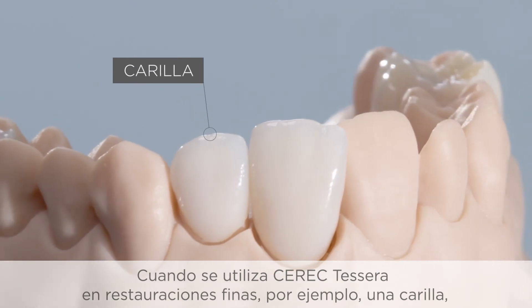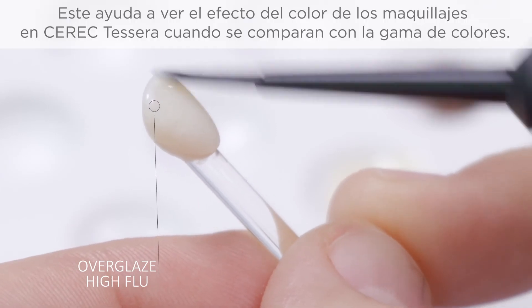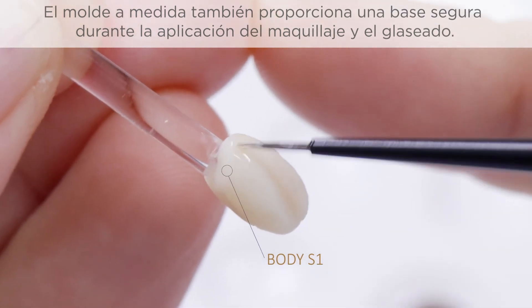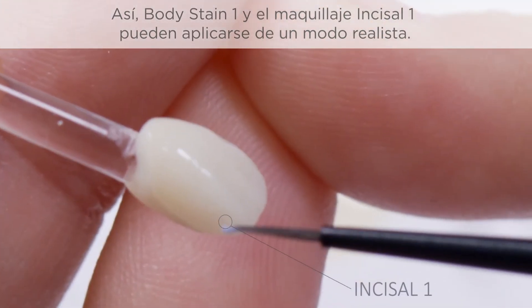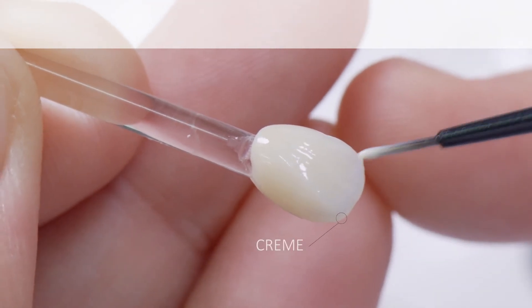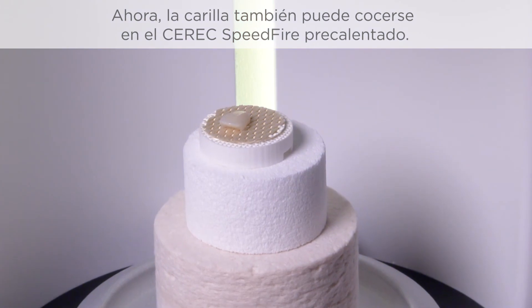When using CEREC Tessera in thin restorations, for example as a veneer, it is advisable to create a resin die in accordance with the information provided by the dentist. This supports the shade effect of the stains on CEREC Tessera when comparing them with the shade ring. The customized die also provides a secure basis for placing the glaze and stain during application. Body stain 1 and stain incisal 1 can thus be applied in a lifelike manner. Here too, the additional effect of light refraction can be created with stain cream. CEREC Tessera demonstrates its special color fidelity and brilliance in direct comparison with the shade sample. The veneer can now also be fired in the preheated CEREC SpeedFire.